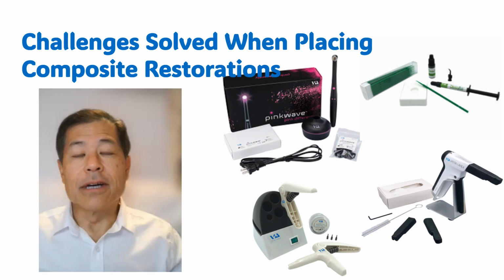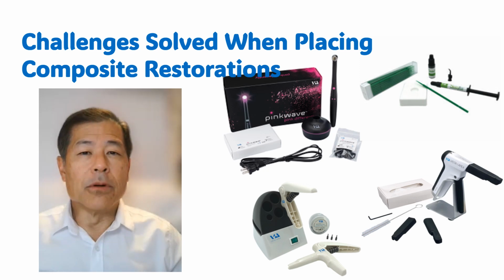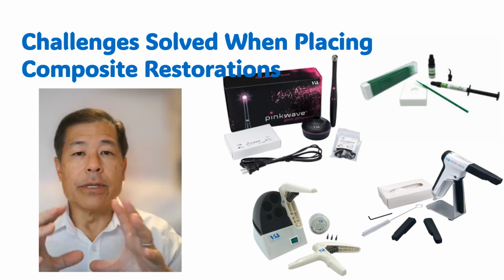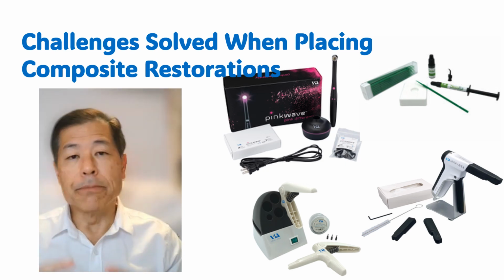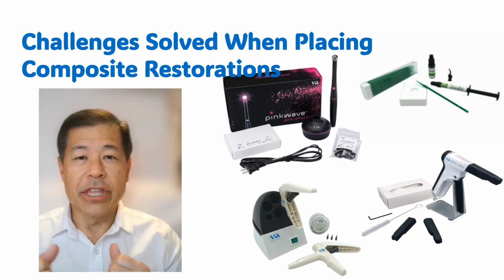I'm Dr. Michael Miyazaki, and today I'm going to discuss one of the most challenging types of composites, I think, for me to place, and that's the composite veneer. Now, one of the challenges is that when we do a veneer, we're covering a large surface area, and sometimes you take that composite and you choose a composite with some really good physical properties, but it's really thick.